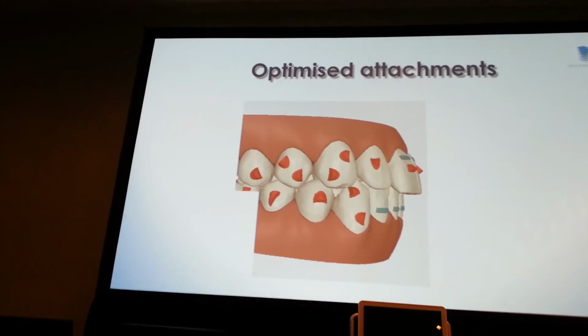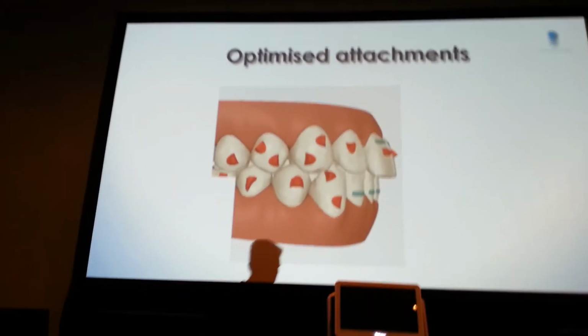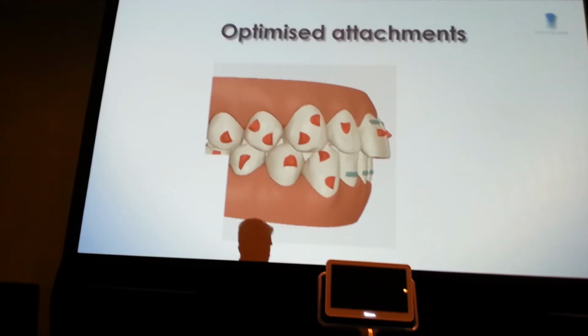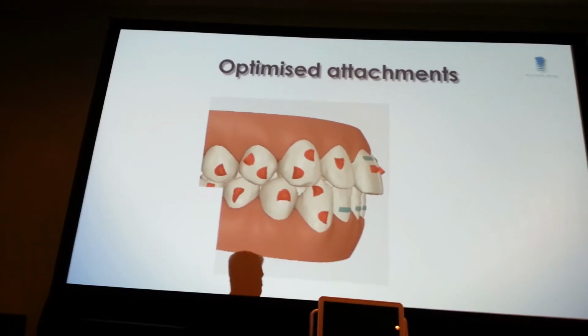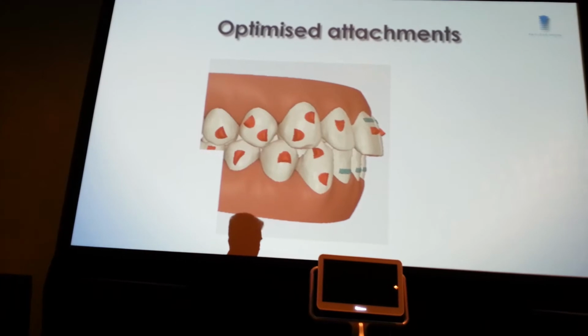What is the difference in terms of your ability to move a tooth between a regular attachment and an optimized attachment? The durability of the attachment? Or the quality?